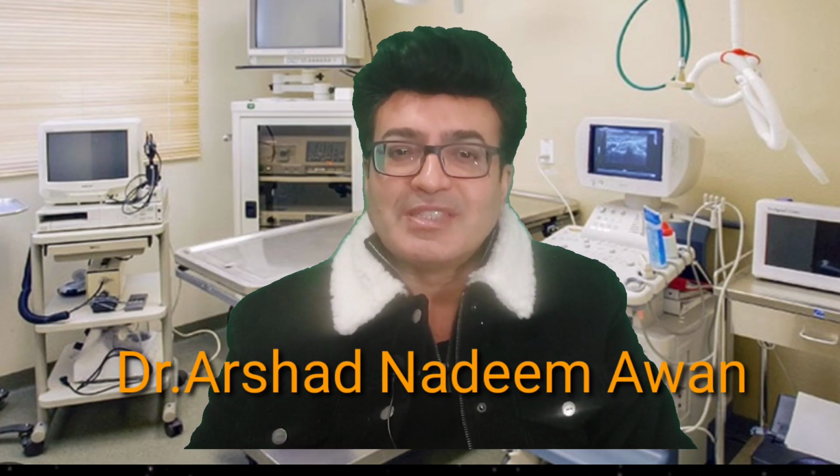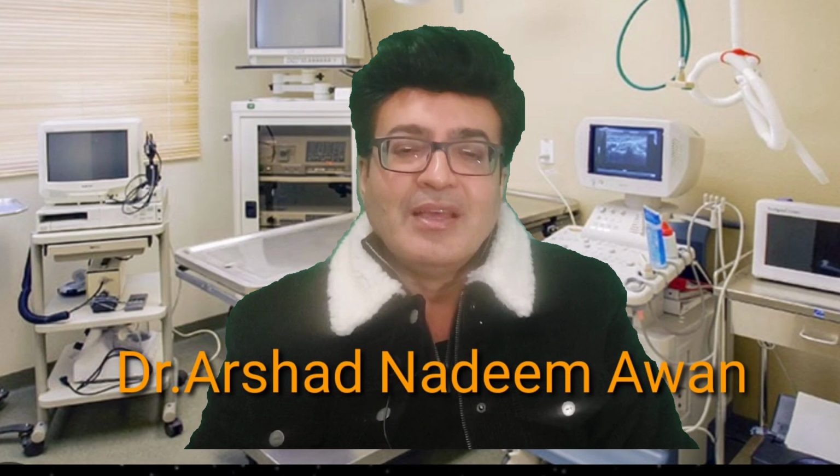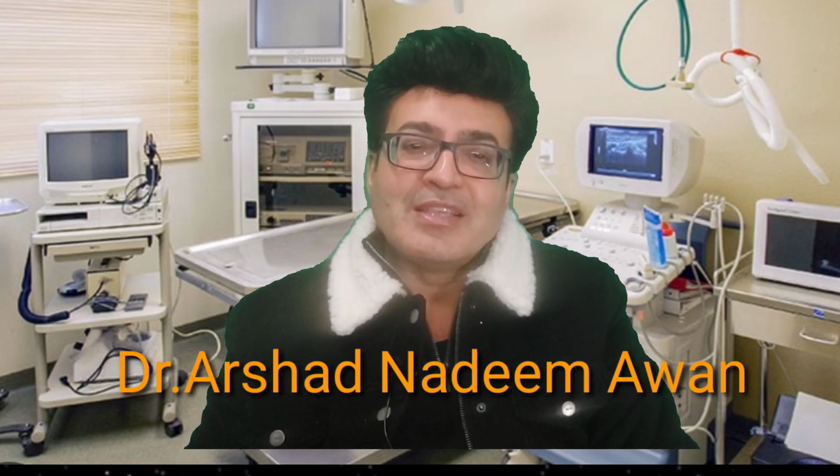Today my topic of discussion is liver cirrhosis. WHO defines cirrhosis as a diffuse fibrosis of the liver and a conversion of liver architecture into abnormal nodules. Three pathological processes combine to form the cirrhotic process. The first is cell death, the second is fibrosis. Fibrosis means when normal cells convert into scar tissue, and the third process is regeneration, development of nodules.